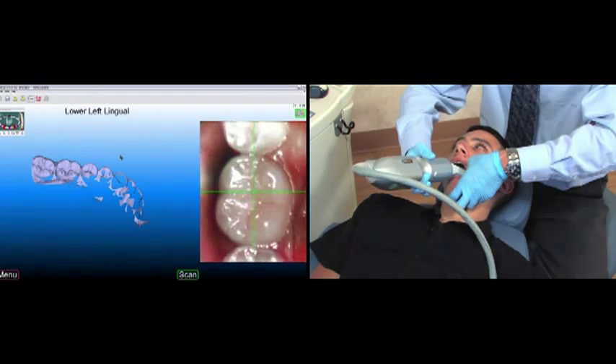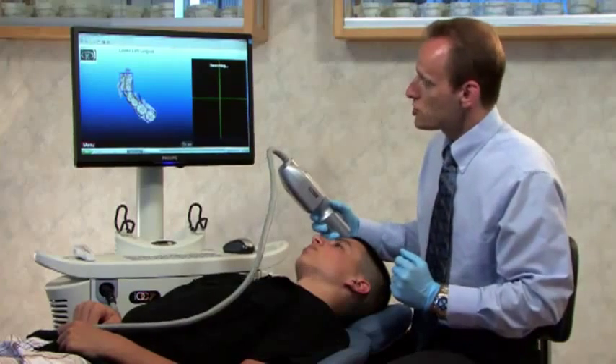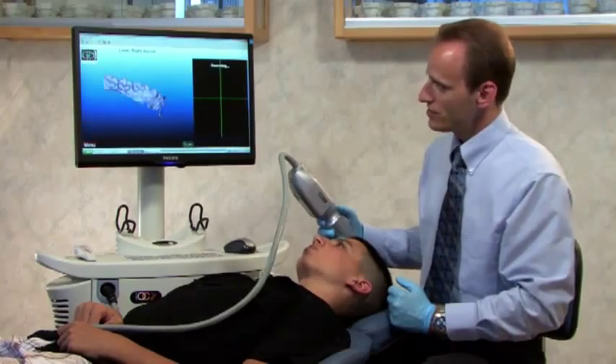Moving forward and pressing the green foot pedal to take a scan. Now that I've finished the lingual side, I'll press the pink pedal once again, then click the green pedal to move to the next segment.